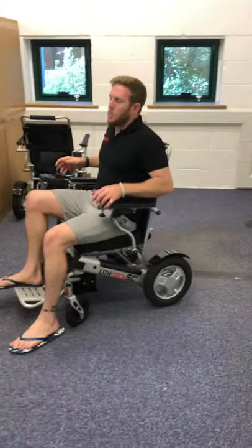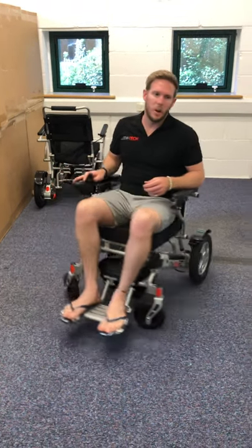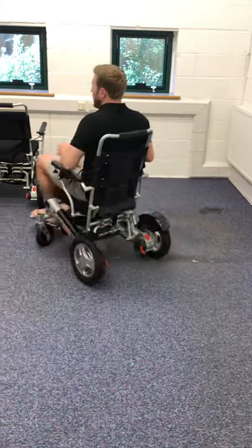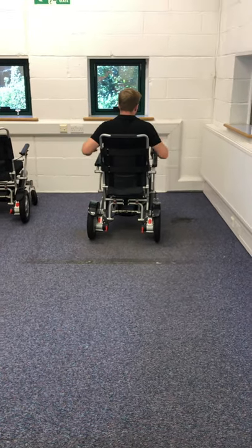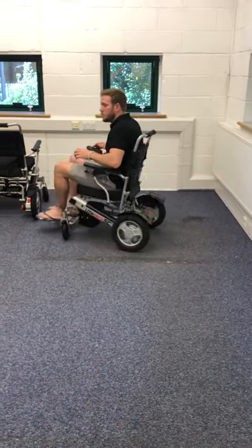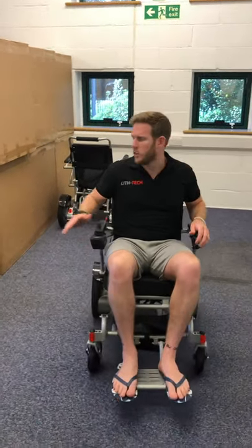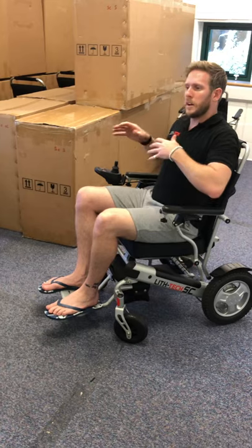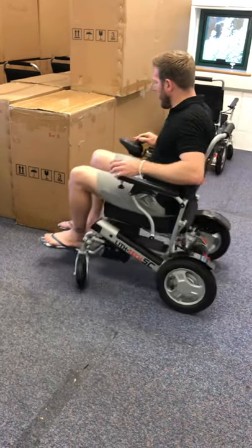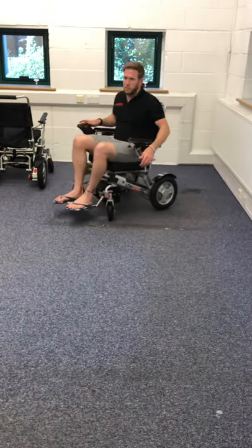I'll give you a quick demonstration of the turning circle. We will be doing an outdoor demo showing how it handles kerbs and things. The turning circle is great. If I take my hands off the joystick the electromagnetic brakes click and stop — these will stop me on an upslope, a downslope, or on the flat. You can spin and reverse simultaneously to avoid obstacles, so if you're about to hit something you can reverse at the last minute. It's incredibly maneuverable and great indoors.